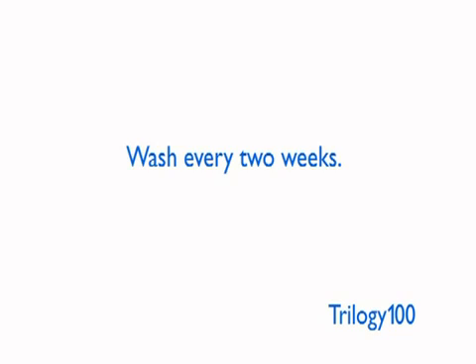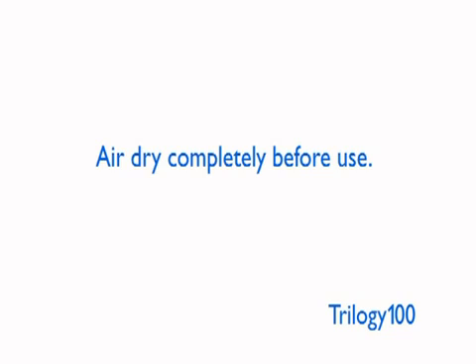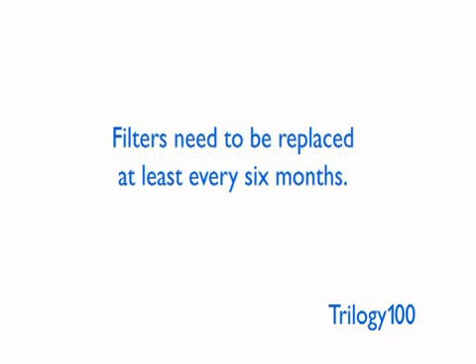Examine the filter you have removed from the unit for cleanliness and integrity. If the foam filter is torn or damaged, it needs to be replaced. Wash the gray foam filter in warm water with a mild detergent and rinse it thoroughly. Allow the filter to air dry completely before putting it back into the device. Even with regular cleaning, filters must be replaced at least every 6 months. Use only Respironics-supplied filters in Trilogy100.